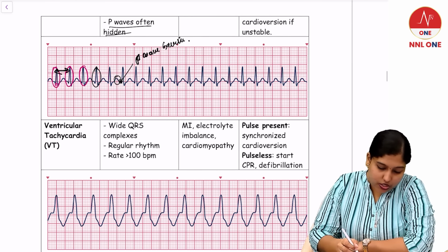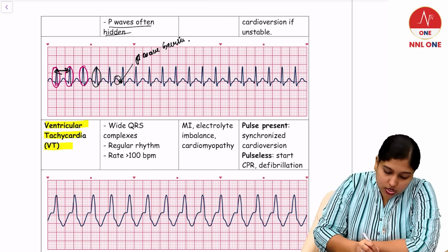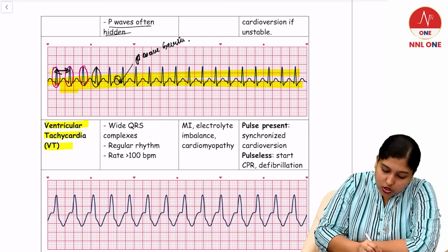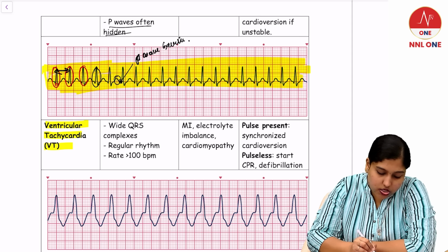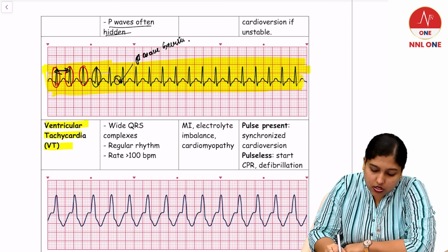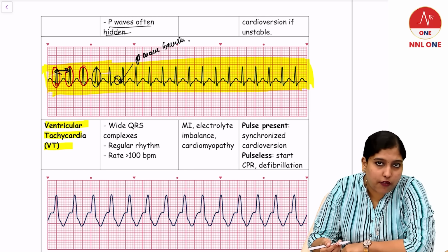So this is the classical ECG pattern of supraventricular tachycardia. Always try to remember these images, because at the last minute image-based questions can be asked. So you should have a quick review.